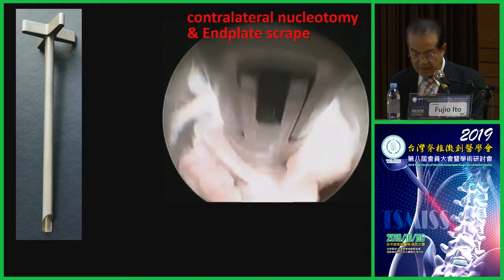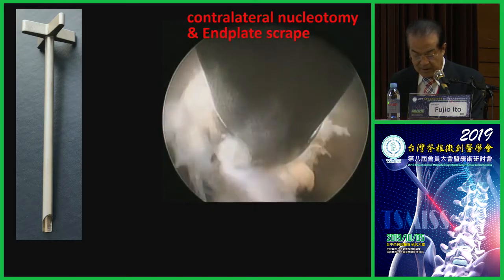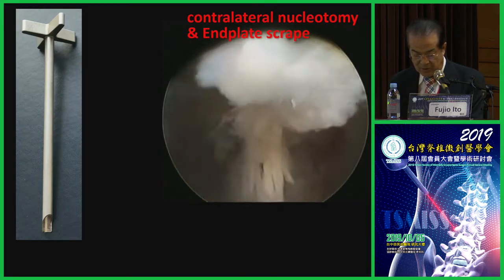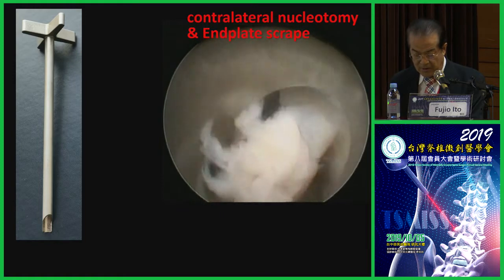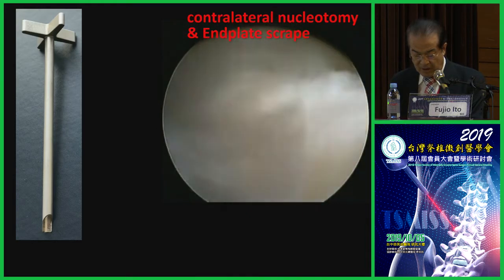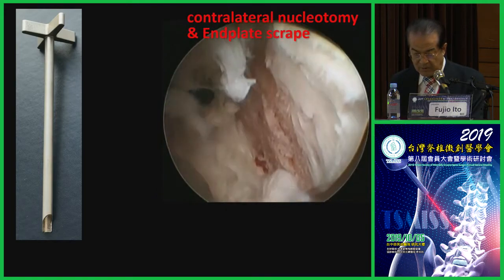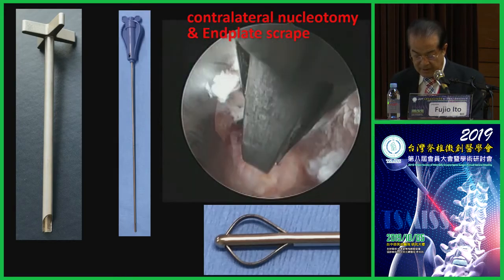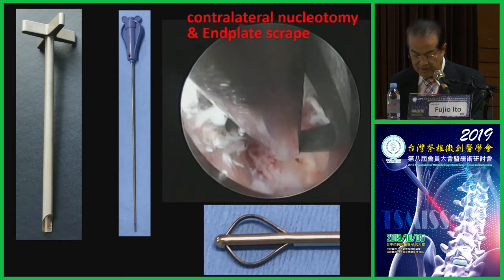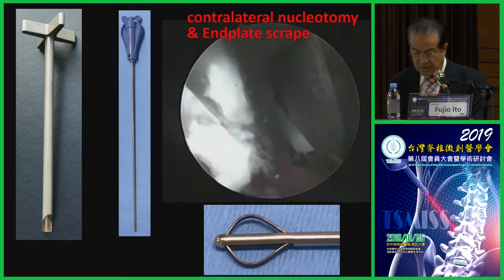A surgeon or assistant stands on the contralateral side and decompresses. In the same way as the ipsilateral side, remove the intervertebral disc with forceps. By rotating the cross outer sheath end plate cutter, the surface layer of the hard end plate can be scraped off. Remove the scraped end plate with forceps. Finally, the expansion fine cutter is inserted with the tip closed, and then the expanded tip can smooth the remaining irregularities on the end plate.